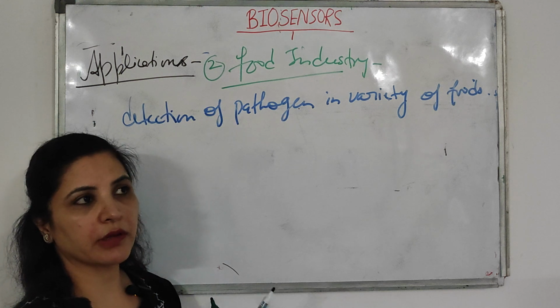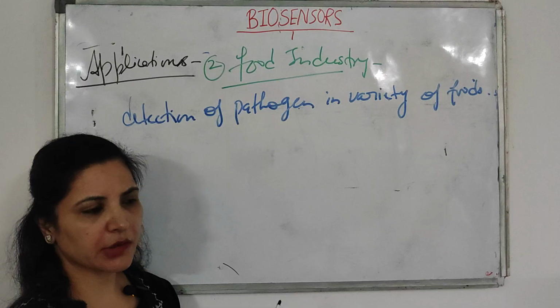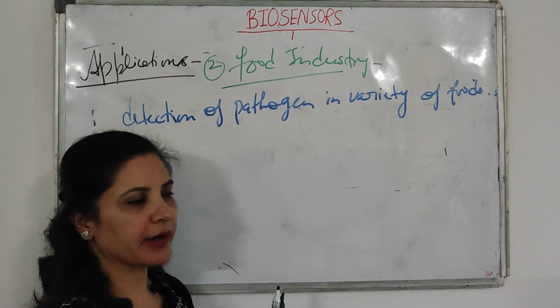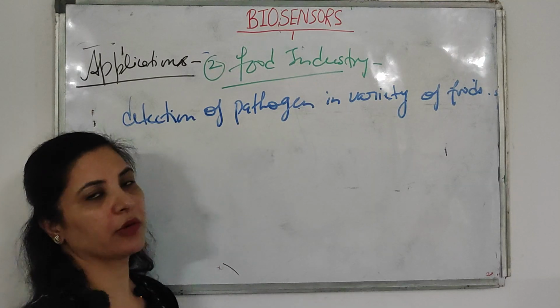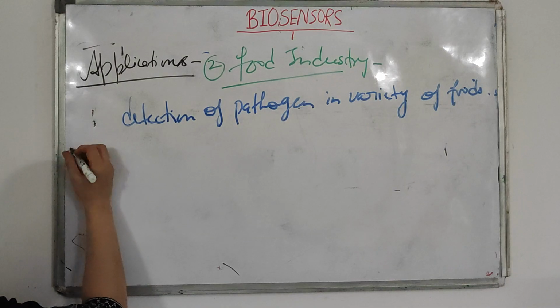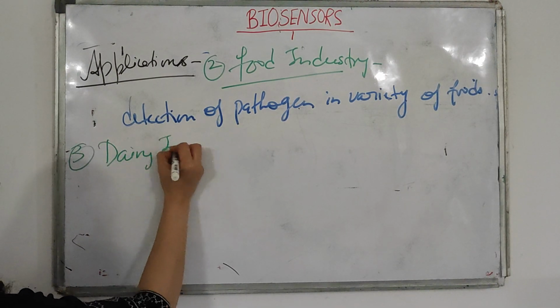Like you want to detect E. coli. You are suspecting maybe E. coli will be there, so you will use the biosensor. You will detect in that food whether E. coli is present or not. Okay, so this is the second application, in the food industry. Third, you will use it in the dairy industry.